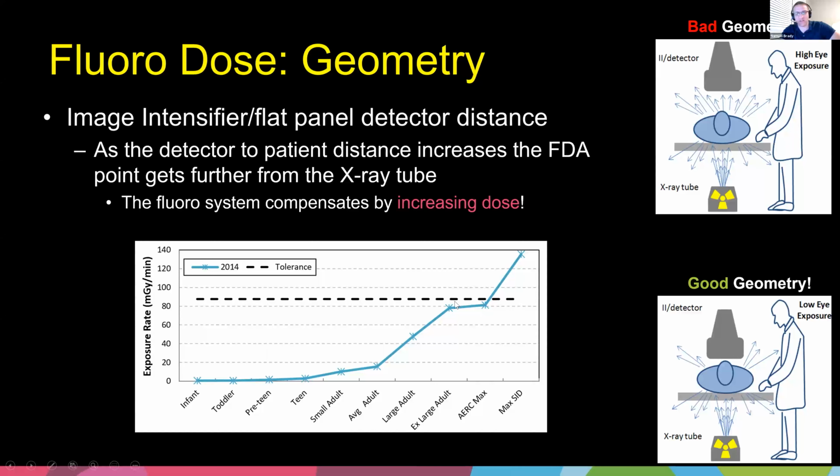The systems, that is supposed to be its maximum output dose at that point that we were talking about, that dose compliance point. The dirty secret is that is true. I can go in and I can use all my blocks of plastic I've been talking about to mimic all my different sized patients. In fact, I can actually go put lead into my beam.